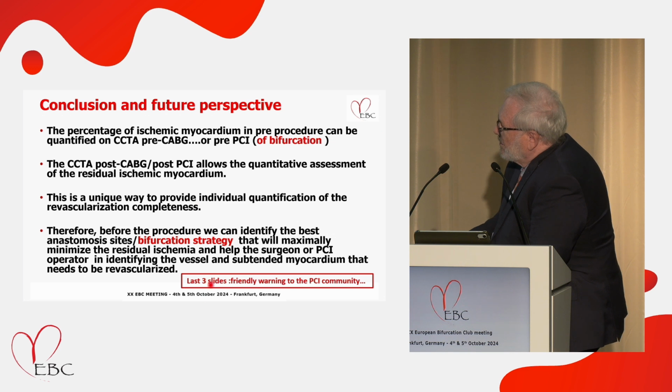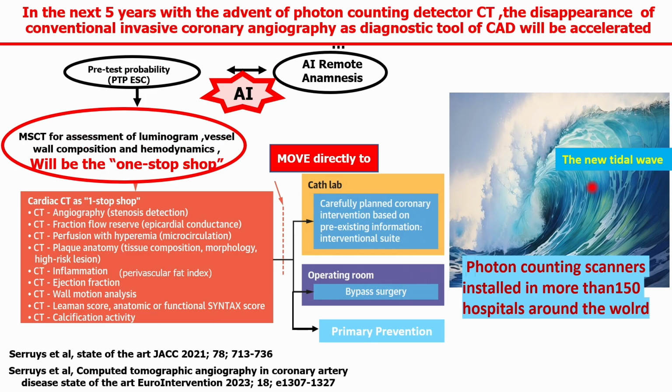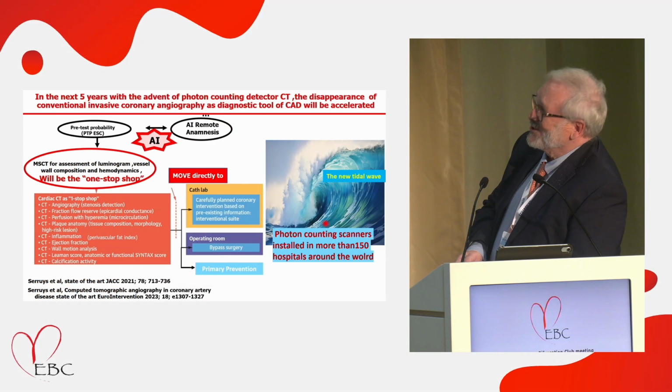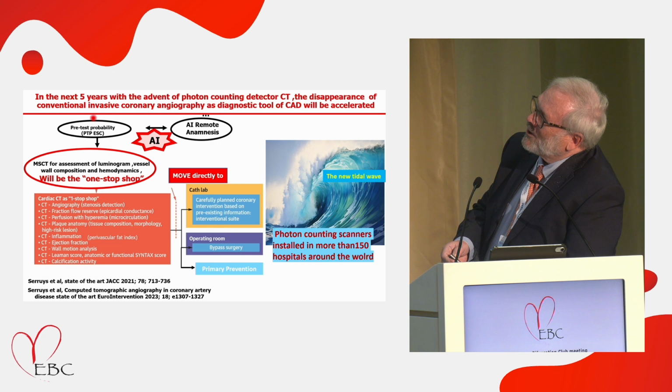Now, this morning I put 3 slides more, and these 3 slides are a friendly warning to the PCI community about what? About the fact that there is a new tidal wave. You know, the last time I used that slide was in Amsterdam in 2000. I think drug-eluting stent is coming. There were only 33 patients, so I used the same slide. The new tidal wave is the photon counting.